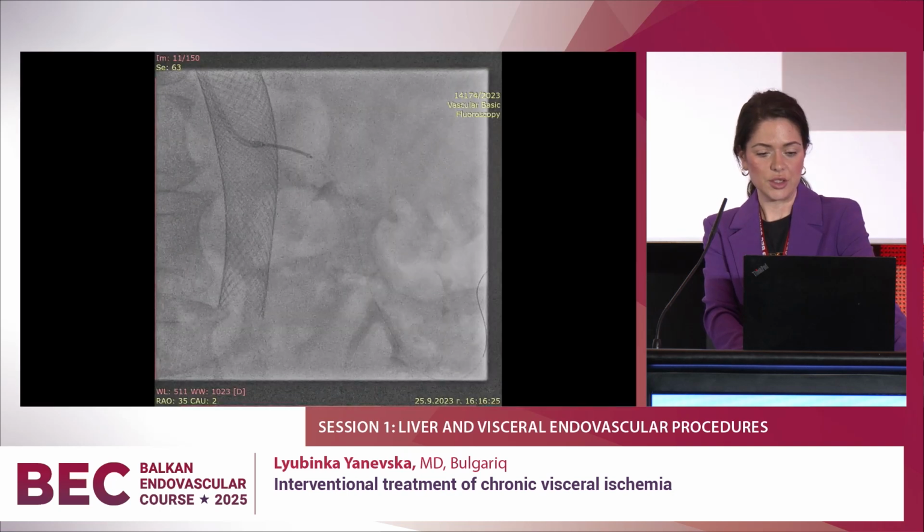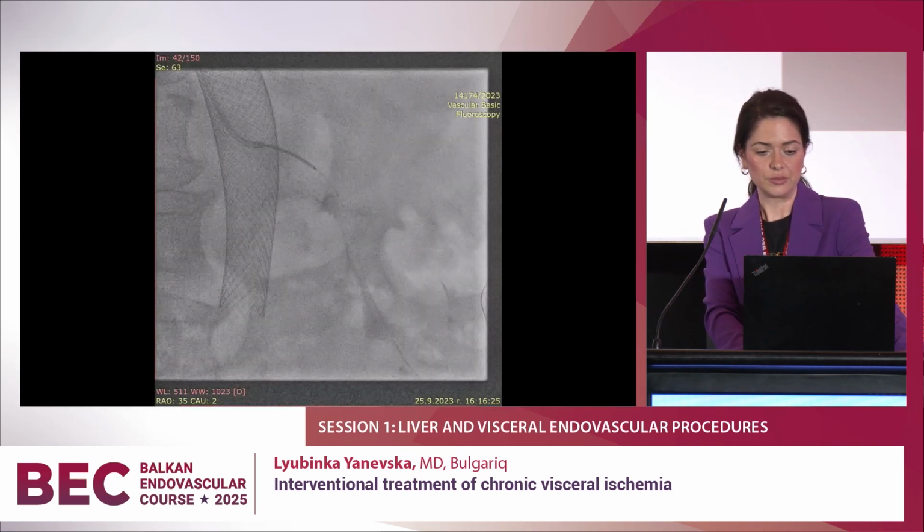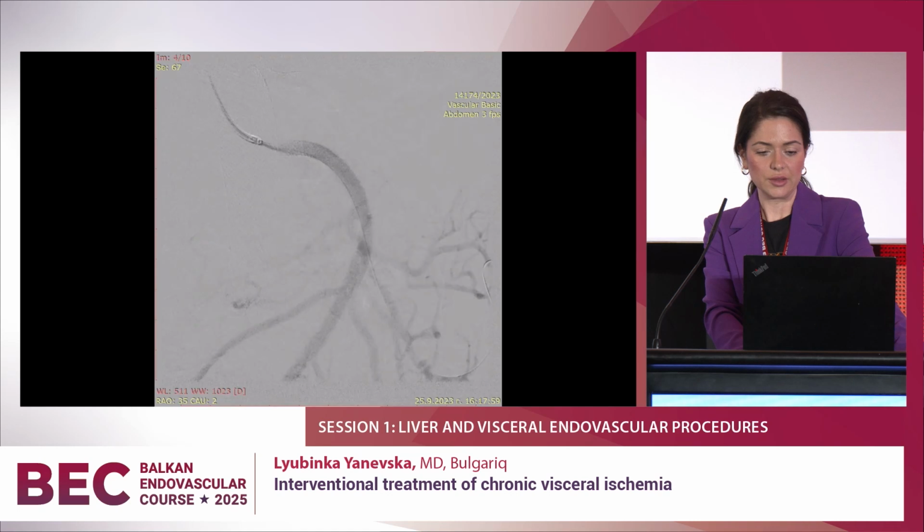With stent implantation. And final result.